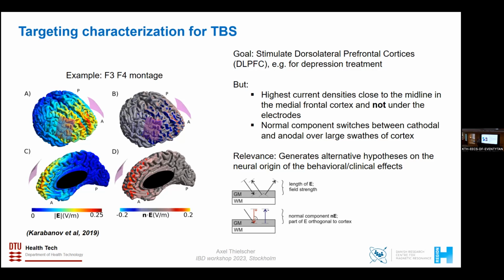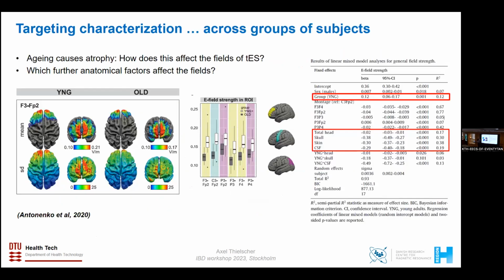And now, luckily, what has happened in the last 2 years is that when people want to now publish a TES, a transcranial electrical stimulation paper, it's now a good habit to include such a picture just to generally show, okay, in general, it seems that my current flow is as I expected and really focus on the areas which I claim it focuses on. Yeah. So that was a big change, very obvious thing, but it helps quite a bit.